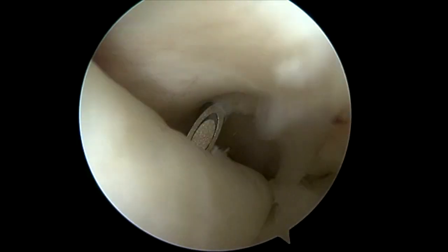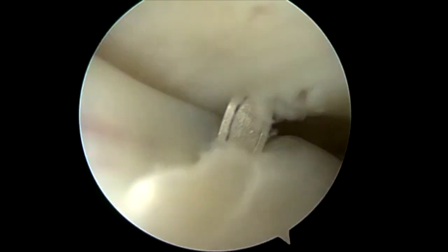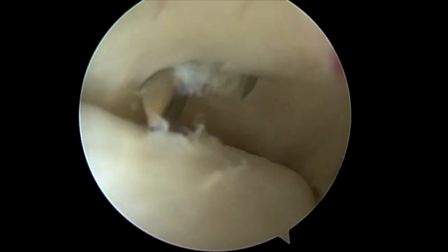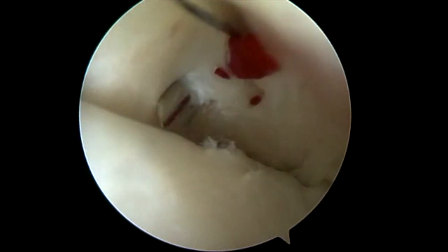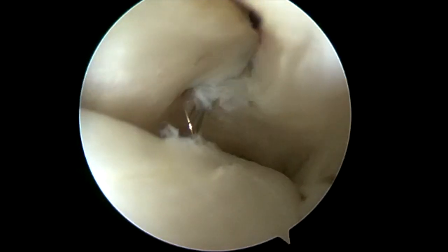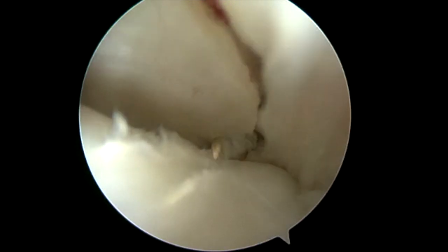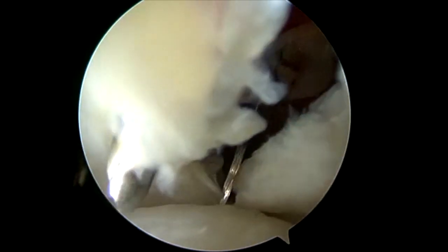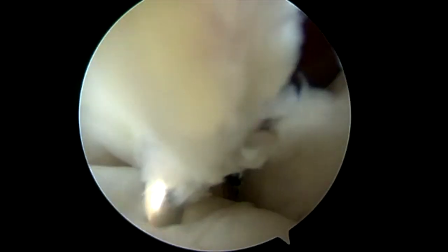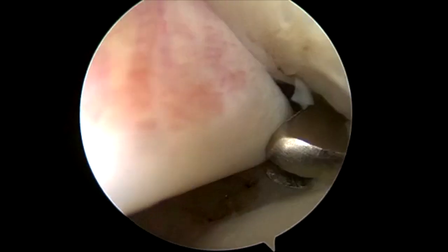Here I am making my portal for the biceps tenodesis. This is an anterosuperolateral portal just off the anterolateral border of the acromion. Take care to get this spinal needle perpendicular to the groove. Now here's the most important part of the whole procedure: this is an 11-blade scalpel cutting down alongside my spinal needle. I'll incise the rotator interval proximally, then flip the blade and go distally — very superficially cutting through the transverse humeral ligament. This far distal release is key to making this procedure easy and doable.